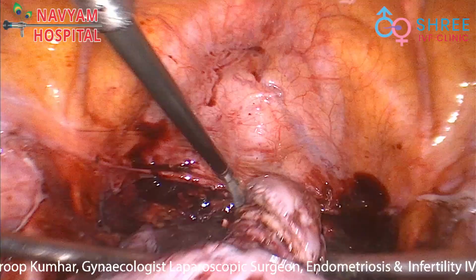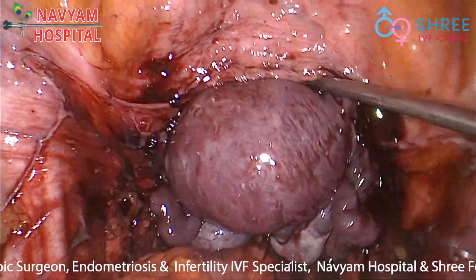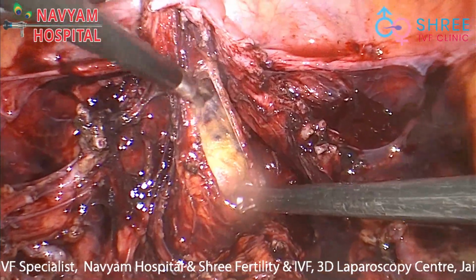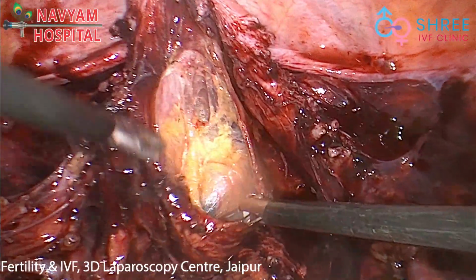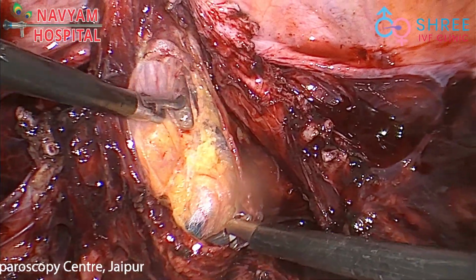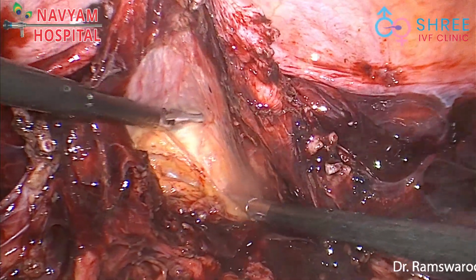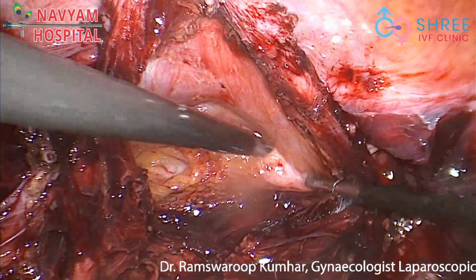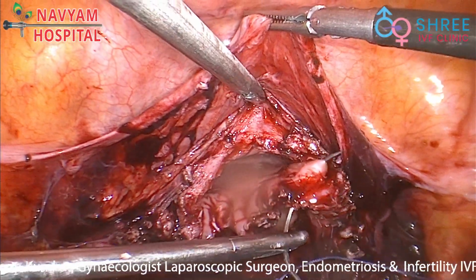After extracting the specimen, we have to dissect the bowel further, so that we can take the sutures very confidently and in the full thickness of the vaginal wall. The vaginal vault was sutured in a figure of 8 manner with 2 stitches only with the help of number 1 Vicryl.